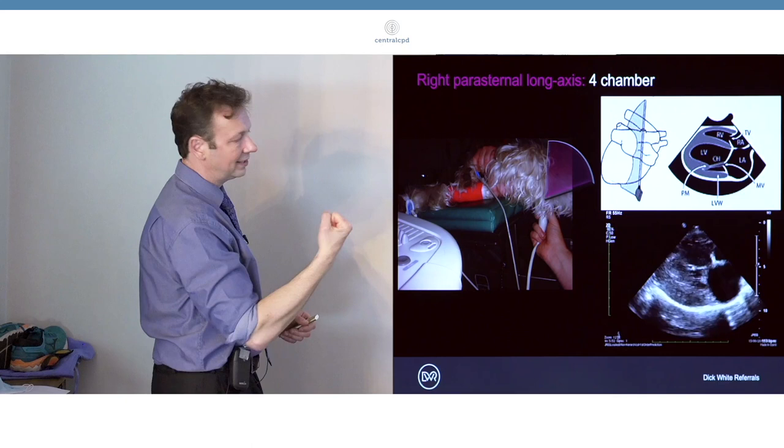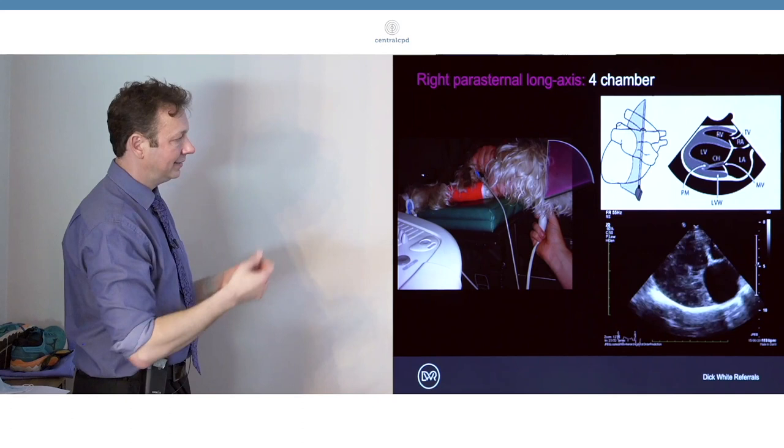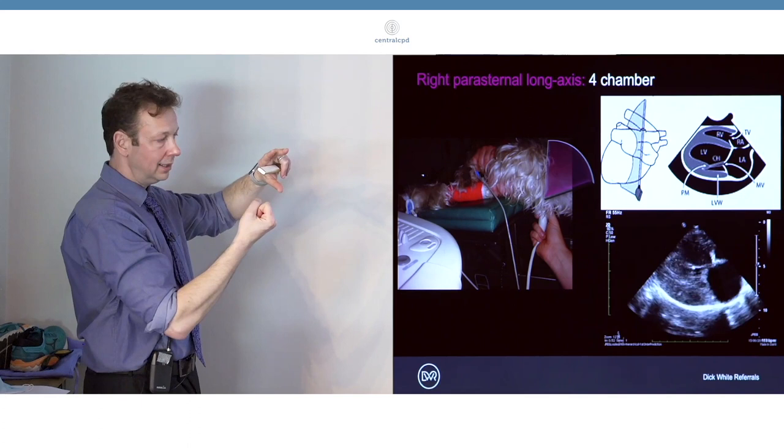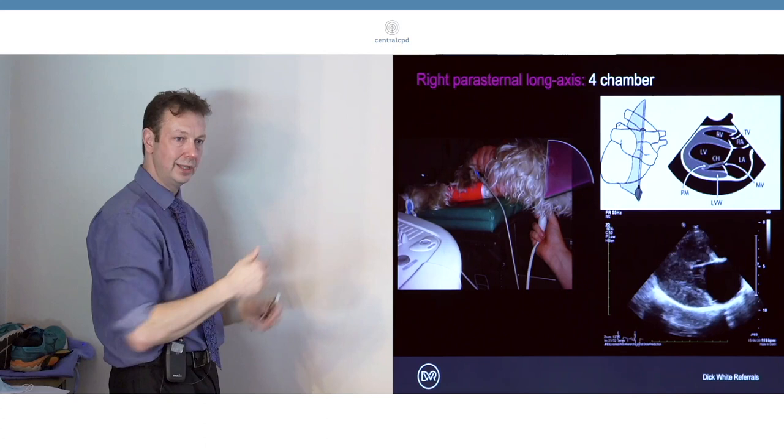One of the things that you'll find you have a tendency to do very often when you're starting doing a lot of echo is to have the transducer too far down towards the sternum. It's often useful to consciously make yourself slide that dorsally within intercostal spaces. You'll find you'll see a lot more of the heart in your image.